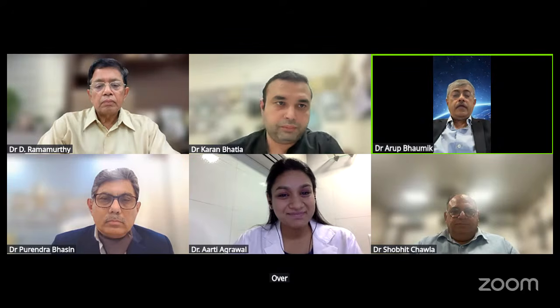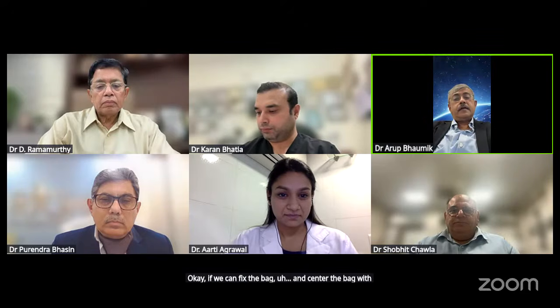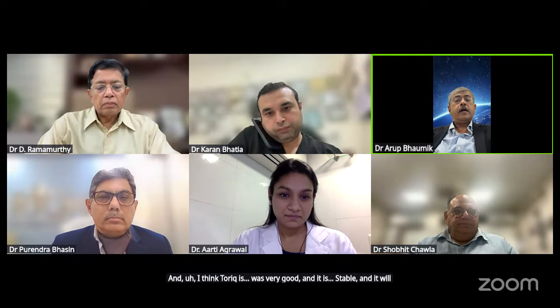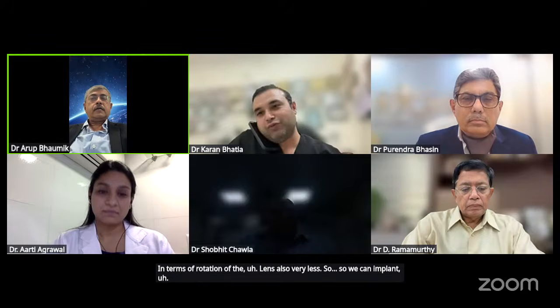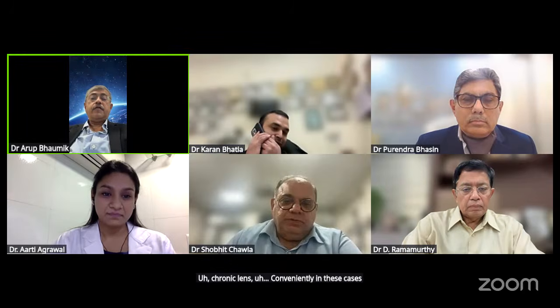Over to you, sir. If we can fix the bag and center the bag with the CTS and or CTR segment, I think toric works very well, and it is stable. The most important part is that if you put the CTR in the bag, then the chance of rotation of the lens is also very less. So we can implant a toric lens conveniently in these cases if we can fix the capsular bag well.